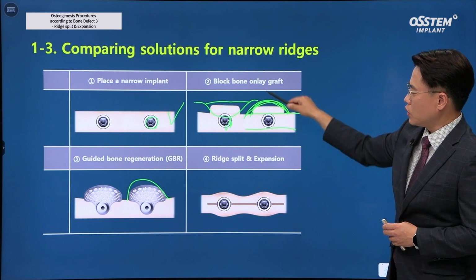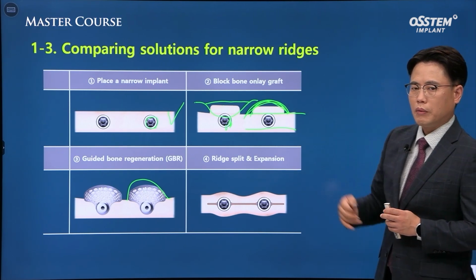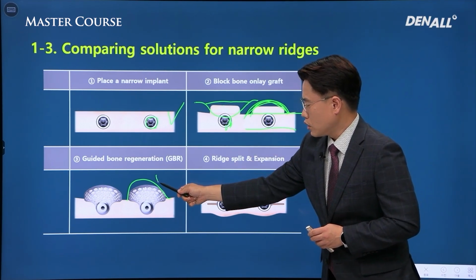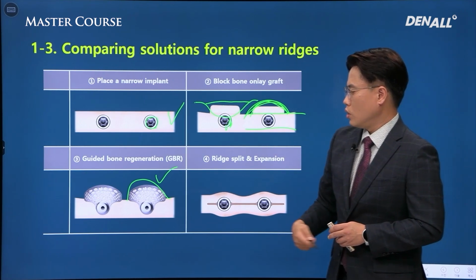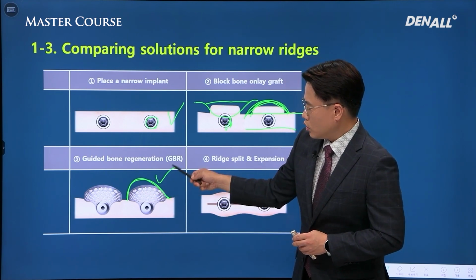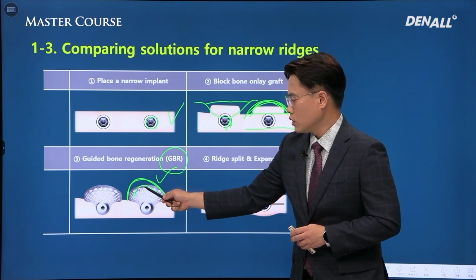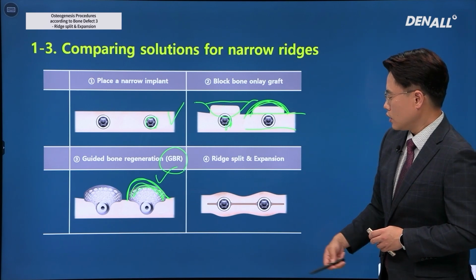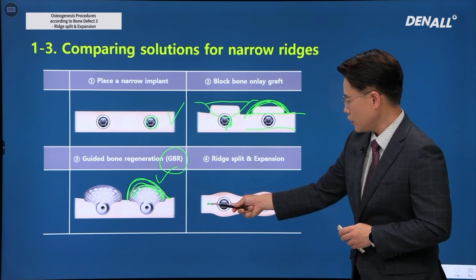Because you're doing graft outside the bony wall at times, it may not be easy to get closure with soft tissue. In the same sense, in the case of GBR, such efforts may be required. Because this is exobony defect, rather than just doing simple GBR, you need to augment it using titanium mesh, so it may complicate things even more. Do the right case selection.